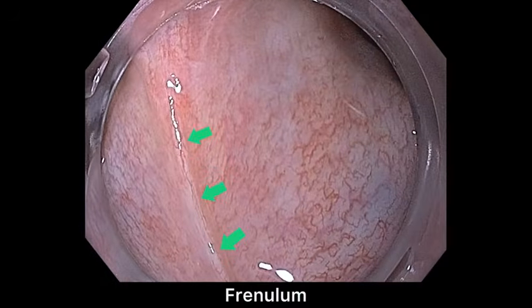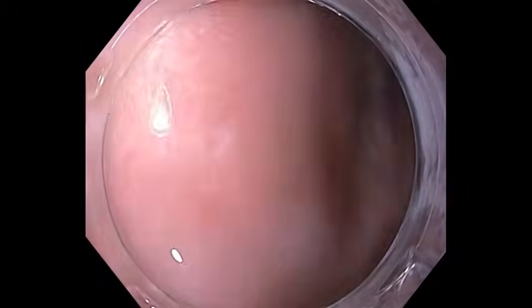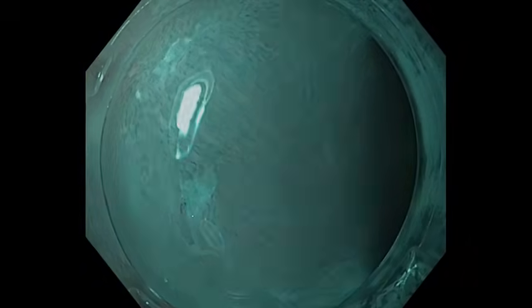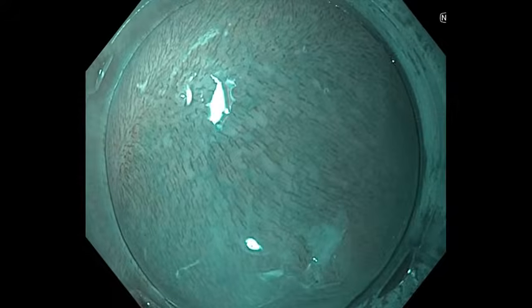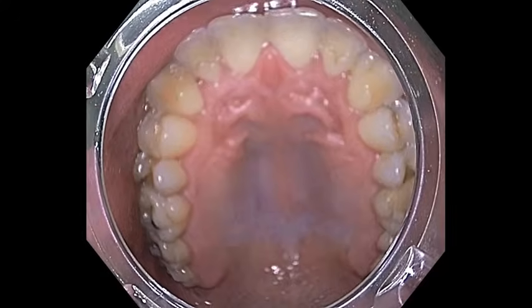Frenulum. Here we see non-keratinized squamous epithelium of the buccal, labial, and alveolar region examined with narrowband imaging and near focus. Buccal non-keratinized squamous epithelium with typical intrapapillary loops, again examined with narrowband imaging and near focus.